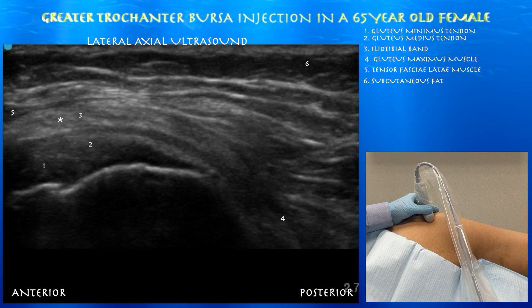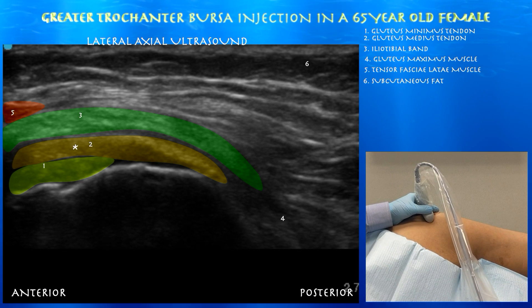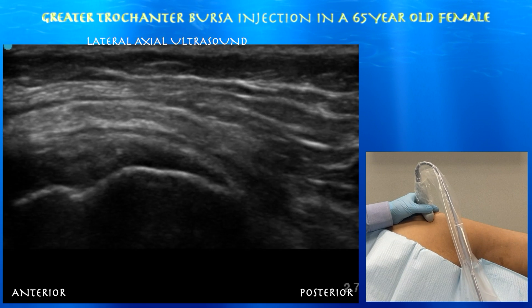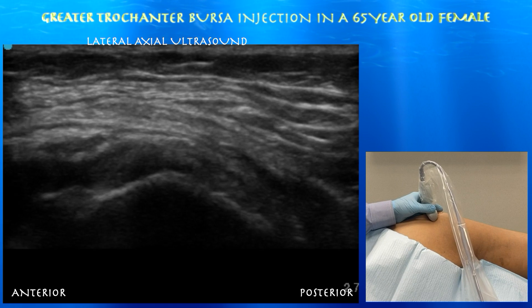You can appreciate a fairly thickened iliotibial band overlying the gluteus medius tendon, which then overlaps the gluteus minimus tendon. You can also appreciate a mildly enlarged trochanteric bursa.